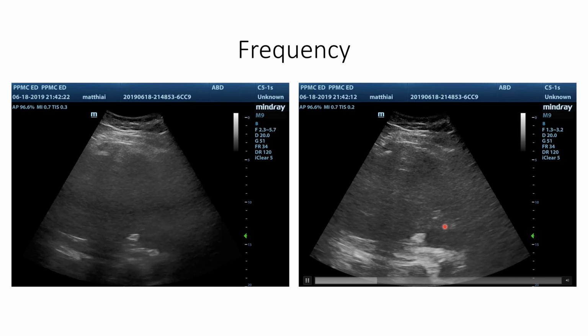And how about this gallbladder that I want to look at? Here I see a nice gallbladder with no echoes in it, really easy to see how thick the wall is. It's a little bit thick because I think I had eaten recently. You can see all this bowel gas and the collapsed gallbladder is making the wall look a little thick.